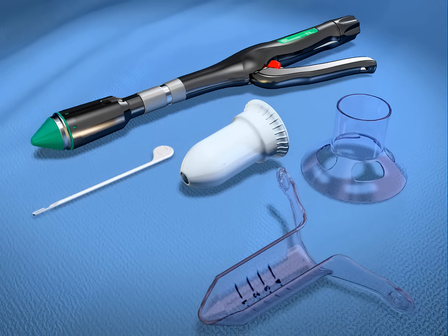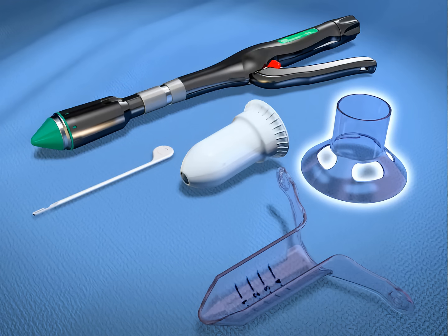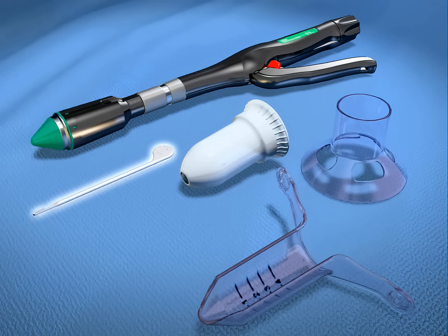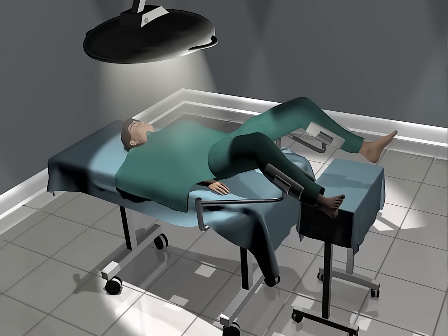The procedure is carried out by using the PPH set of instruments. The kit includes a 33 mm hemorrhoidal circular stapler, a circular anal dilator, a purse string suture anoscope, and a suture threader. The patient is positioned in the prone jackknife or lithotomy position.